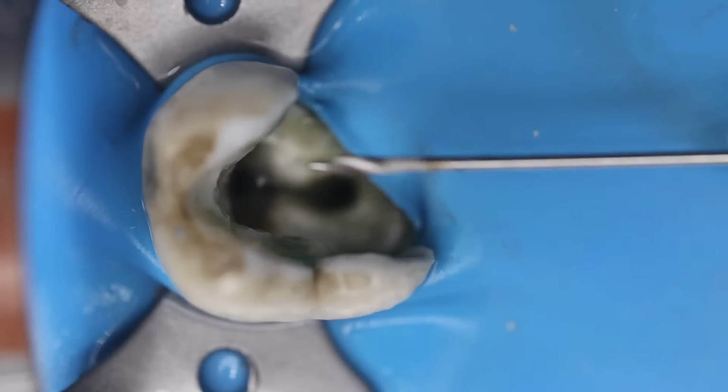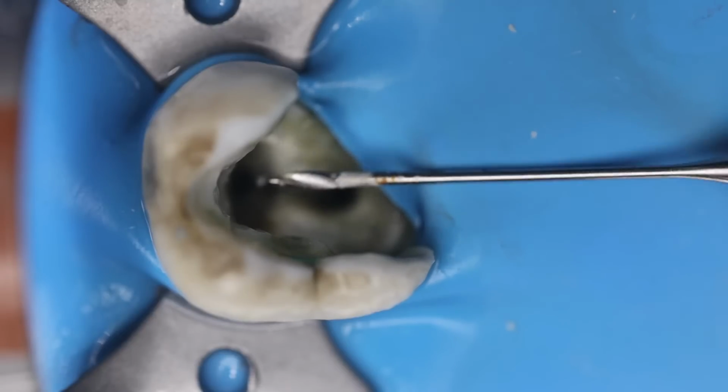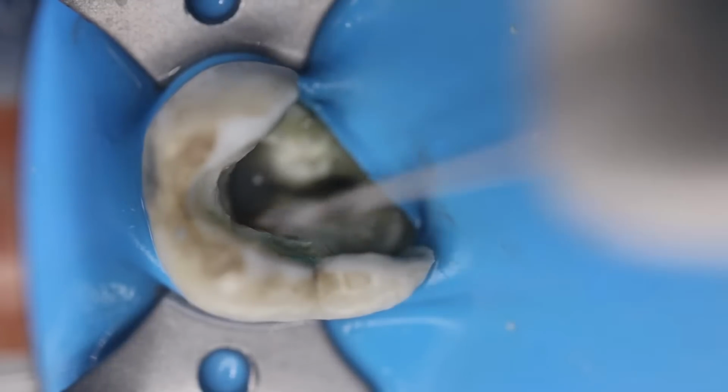Okay, now our handpiece is ready. This is a GG drill size 1. You can always begin with size 1 and go to a maximum of size 2. Don't go beyond that. Just insert it into the orifices, and don't worry, it will not break. Even if it breaks, it will break from this end, not from the tip, so you can easily retrieve it. But you have to move it into the coronal part for orifice enlargement, as it is meant for that only.